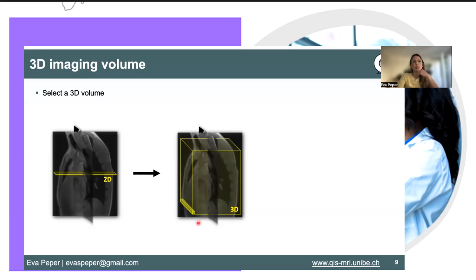That means that if you want to acquire this 3D volume throughout your scan, you have to, as with every MRI scan, acquire it voxel by voxel, imaging point by imaging point. It's not like a photo as we have in CT. So if we want to acquire one single imaging point, I'll just show some basic MRI stuff, but not in too much detail.